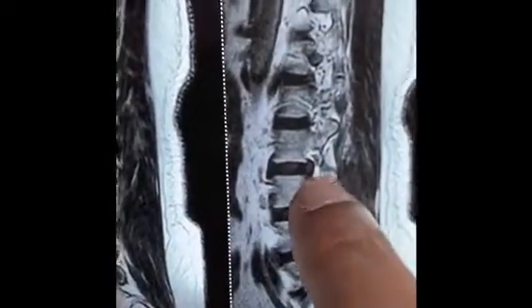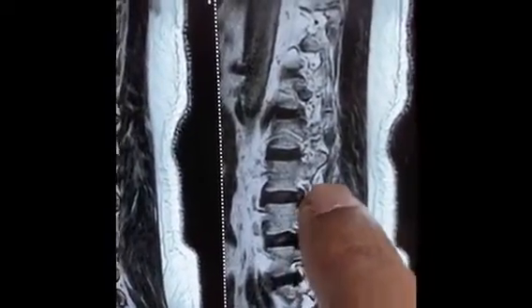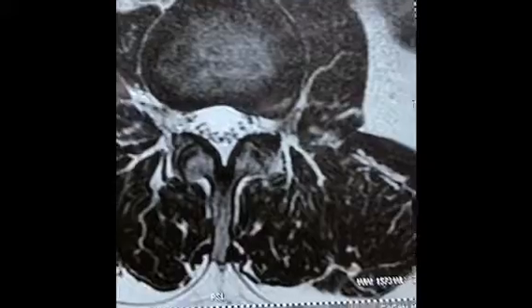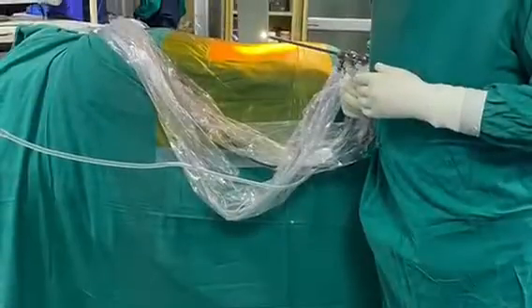So ladies and gentlemen, if we look at the MRI of the patient, we find that he has a slip disc on the left hand side at L2-3 level, which is an extra foraminal disc as you can see here. This is the cause of his paralysis in the left lower leg, so we have to remove this disc in order to decompress the nerve and cure it.